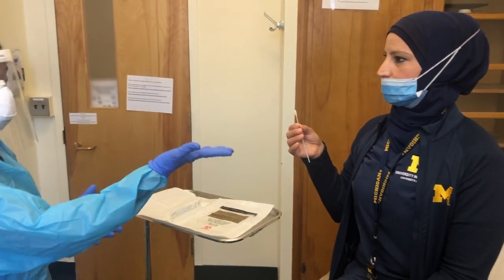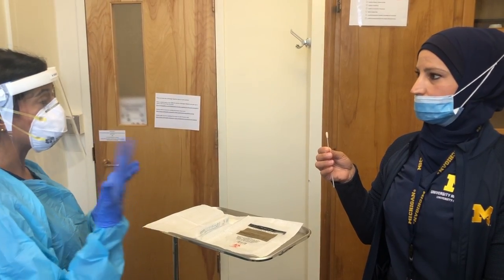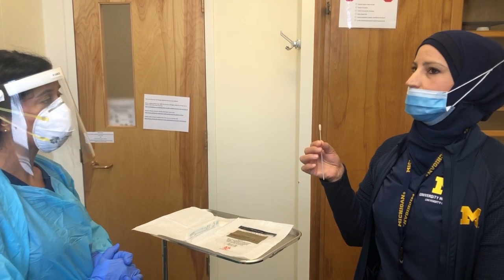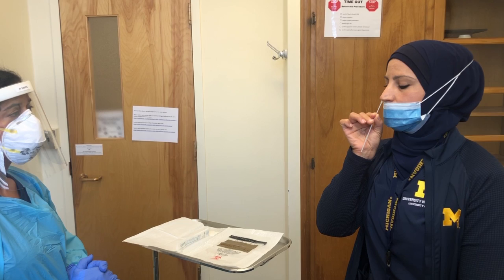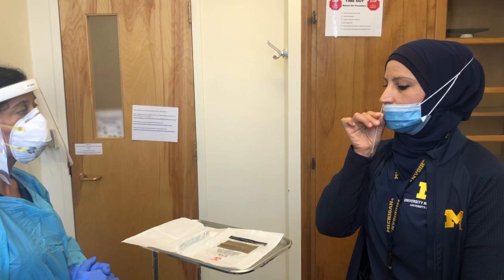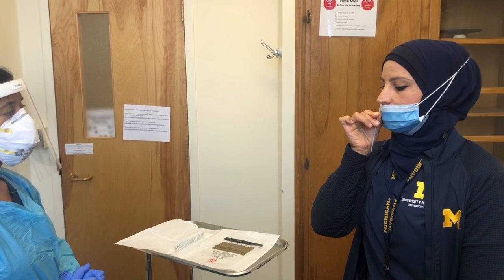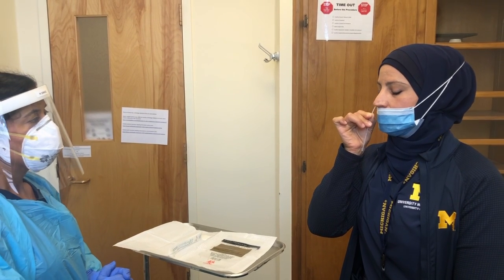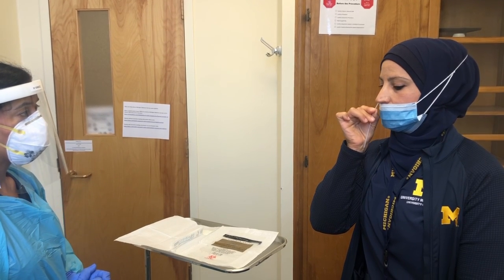Now when you're ready, you can see she's lowered her mask so only her nose is exposed. And you can go ahead and tilt your head back about 15 to 30 degrees. Gently insert your swab in one nostril so that it's parallel to the roof of your mouth. And keep going until you hit resistance, which should be about 3 to 4 centimeters or 1.5 inches. So it looks like you might not be in far enough.